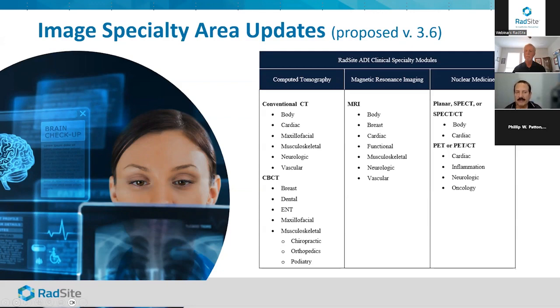From my perspective, I tend to think less of the importance of the number of slices per se in CT, or less important the actual field strength itself for MR in comparison to how these systems actually do empirically when our expert physicists end up testing them.